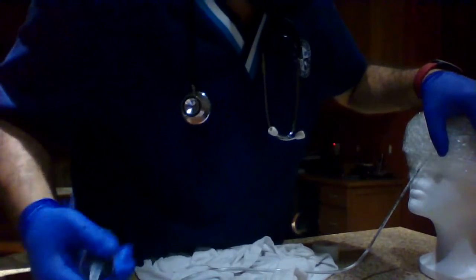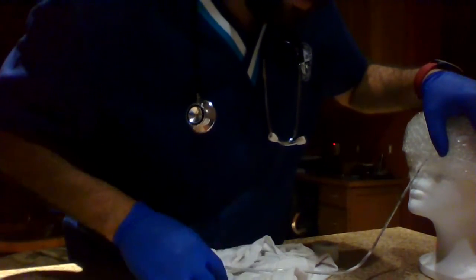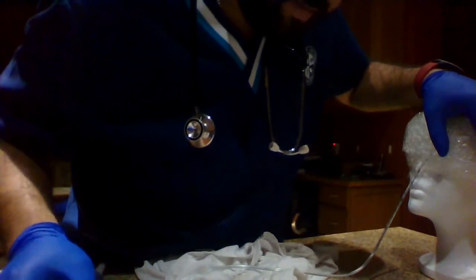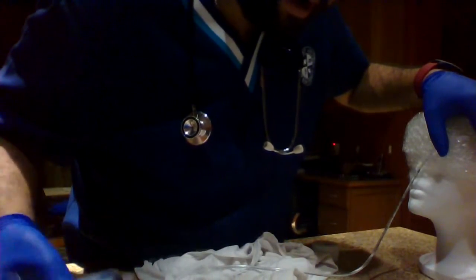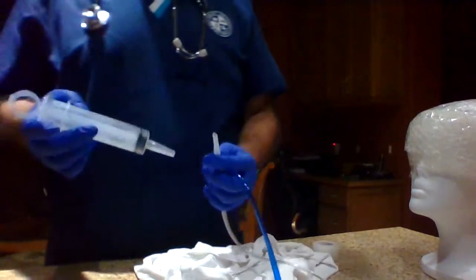So after placement, you need to verify that it is in the distal and it's in the suction, and make sure everything's good. You need to make sure that you're in the right area. So what we do here, we're going to collect a specimen.